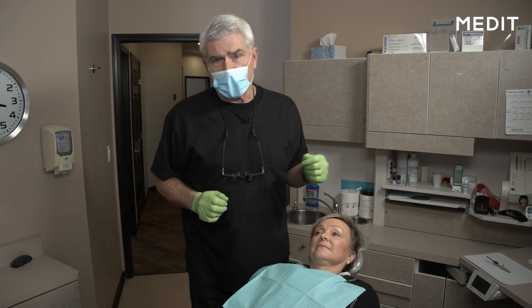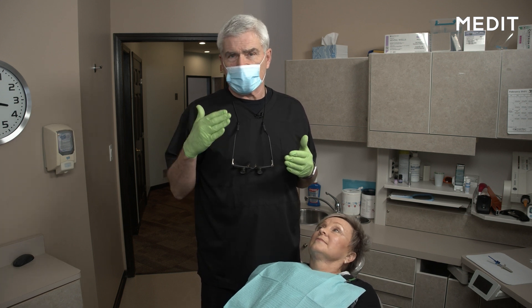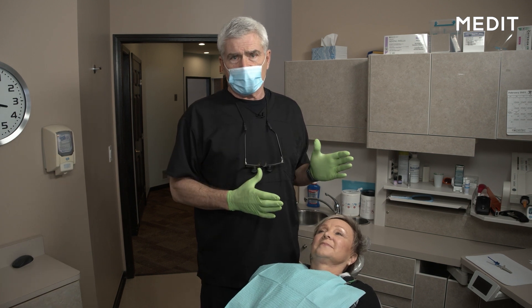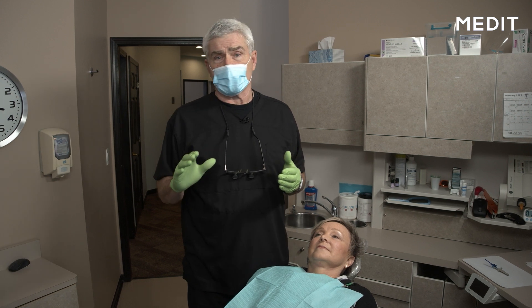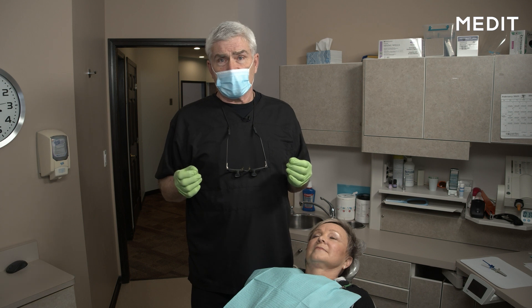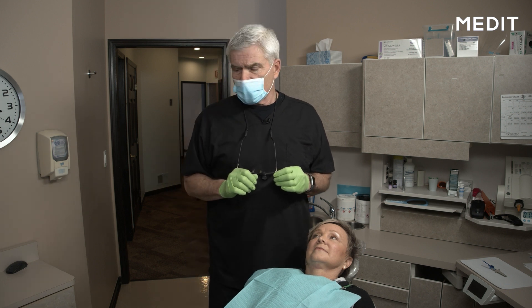What I'd like to show you now is how we would do a case for dental sleep medicine. It's important that we walk through all the steps first verbally so you can follow along. I'll be paying attention to our patient Denise, and you'll be seeing everything we're doing on the screen as well as intraorally. The first thing we're going to do is go to the software and make sure we've got everything set up to do a dental sleep medicine case. My narrow focus is dental sleep medicine, so I'll need an upper and lower full arch impression model scanned, and then a bite relationship taken using a George gauge.